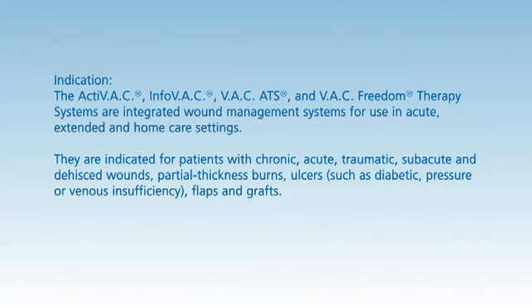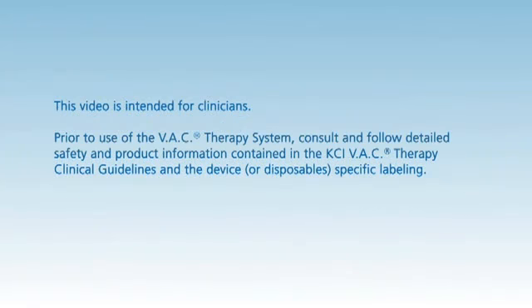The ActiVac, InfoVac, V.A.C ATS, and V.A.C Freedom Therapy systems are integrated wound management systems for use in acute, extended, and home care settings. They are indicated for patients with chronic, acute, traumatic, subacute, and dehisced wounds, partial thickness burns, ulcers such as diabetic, pressure or venous insufficiency, flaps, and grafts. This video is intended for clinicians.